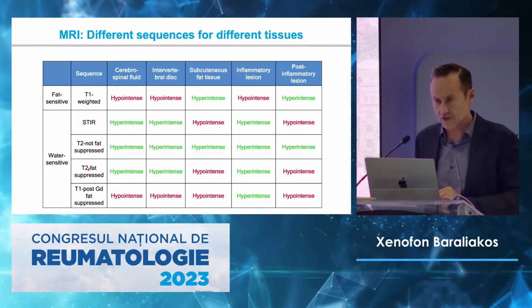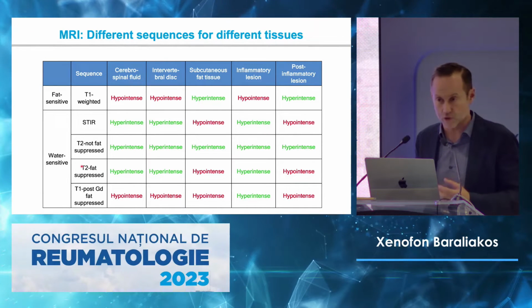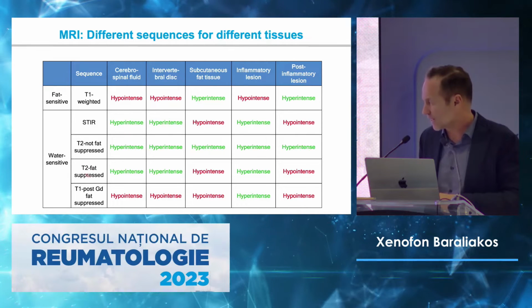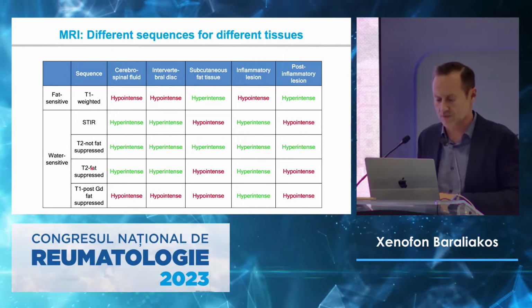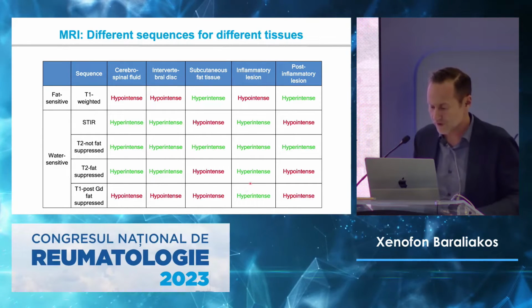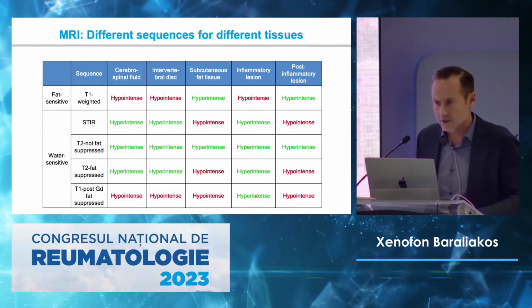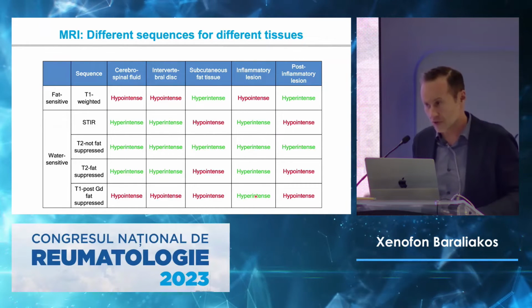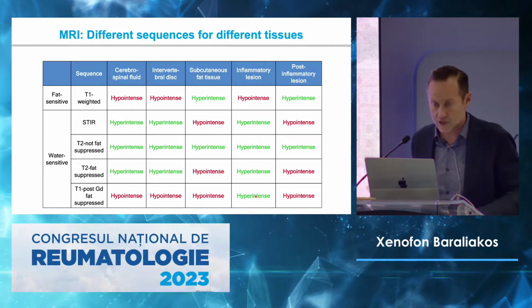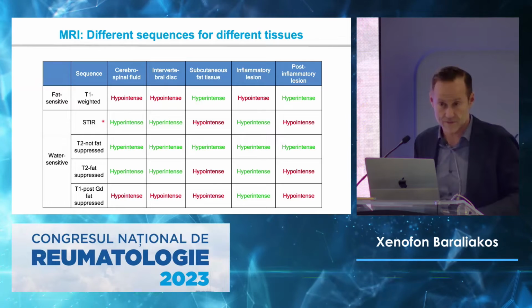There might be that you can get the fat out of the T2 sequences by the protocol of the MRI. Well, that is not being done anymore. Sometimes you may see those images. And the gadolinium images, they're also good because they're showing inflammation. It's positive here. But it requires more time. You give the gadolinium, the injected gadolinium, it's more costly. It obviously also has adverse events. The STIR and the T1 images are good enough.